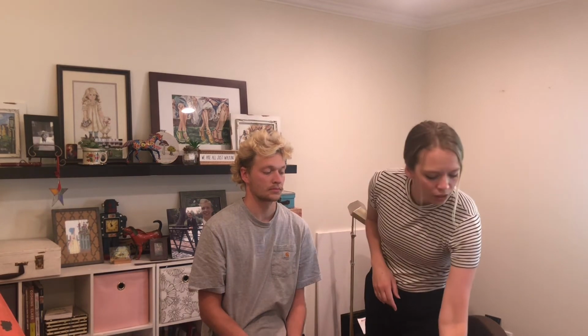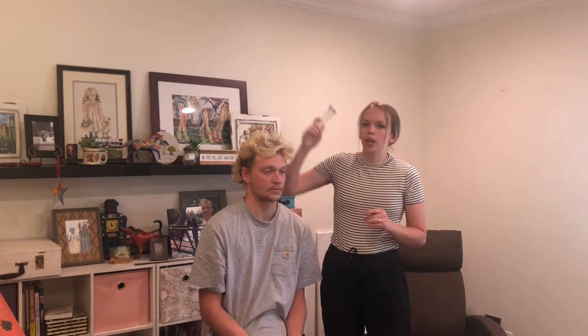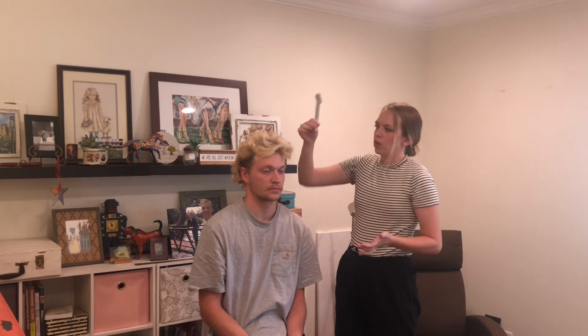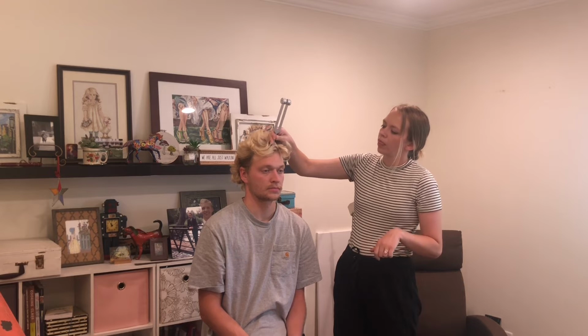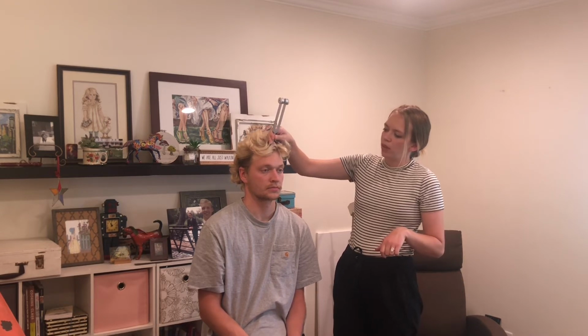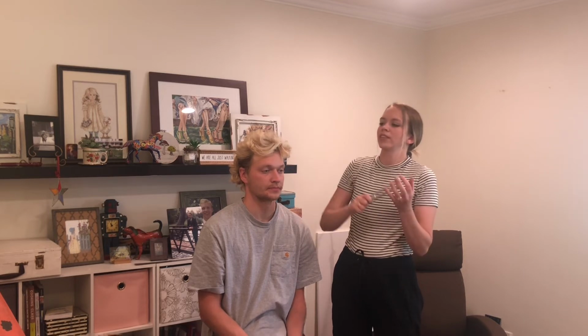After we look at the ears, we can go on to our hearing assessment. We'll use a tuning fork to check lateralization. So we'll place the tuning fork at the top of the head and then check to see if one ear is stronger hearing than the other, or if they're equal. Did you hear them equally on both sides? Yep. Perfect. So then we'll check the left ear and then go on to the other one.